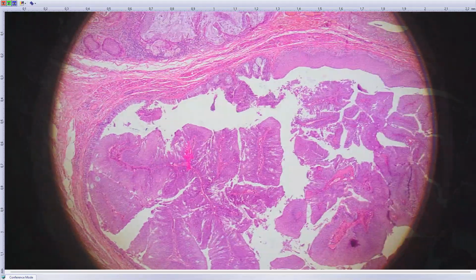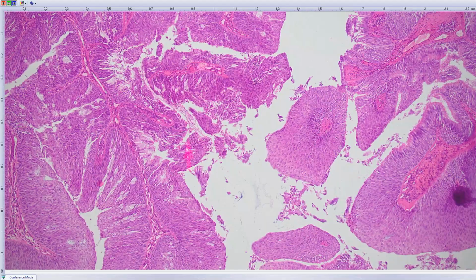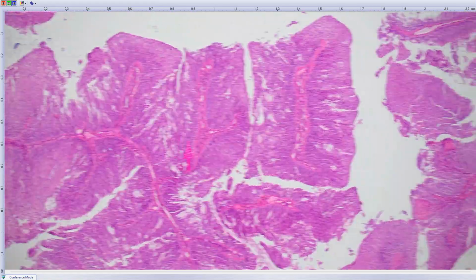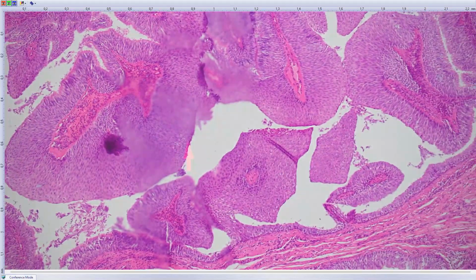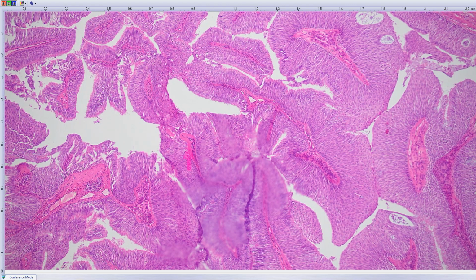But still, look at it, what's here. There is something really like papilloma. Not entirely benign, yeah. But I'm sure that every pathologist saw small papillomas arising in conjunctiva, and it looks like even just a big exaggeration of the same thing.